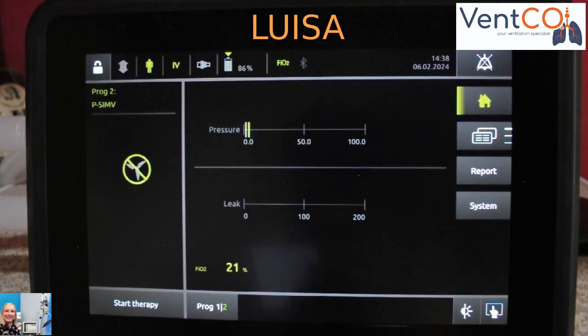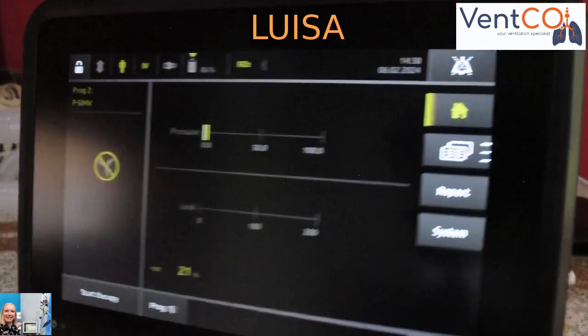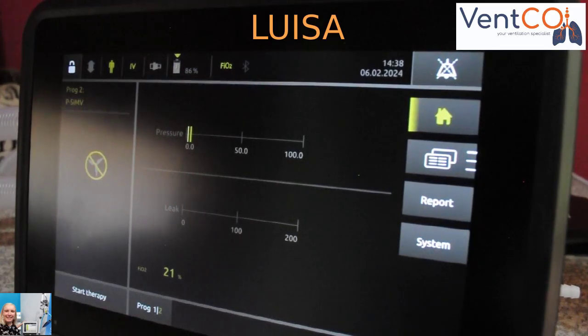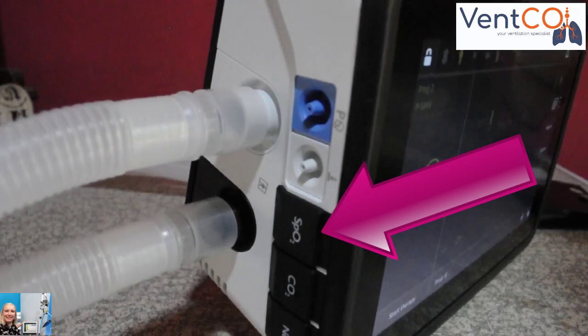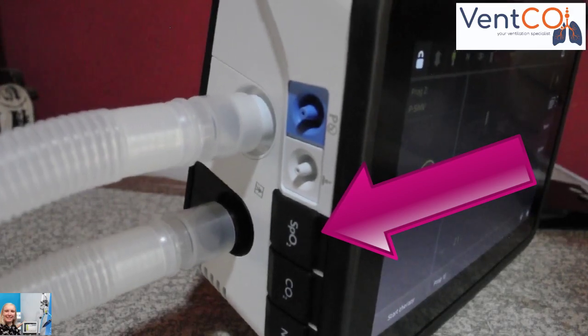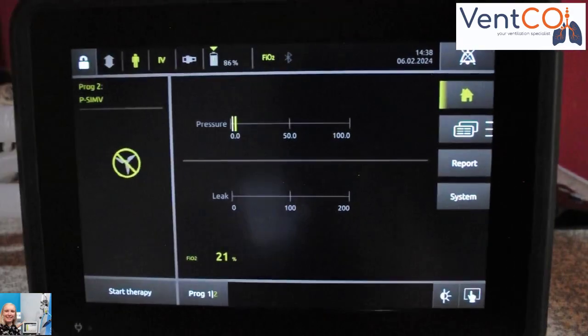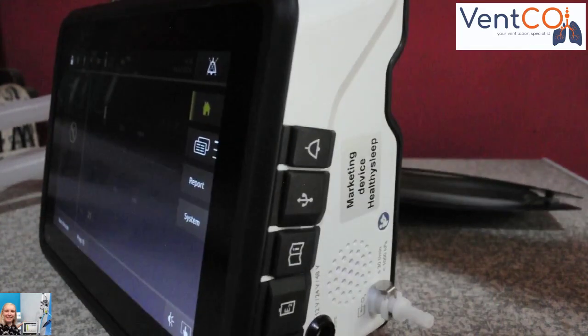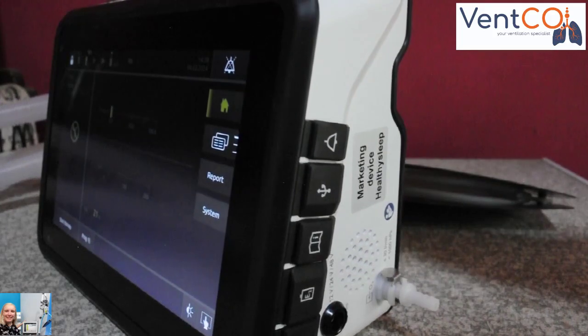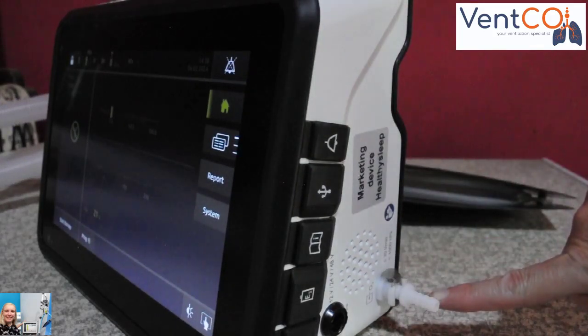Saturation monitoring, which is an optional extra, can also be done, which will be connected there, as you can see. An additional oxygen supply of up to 30 litres per minute can be given via a flow meter.